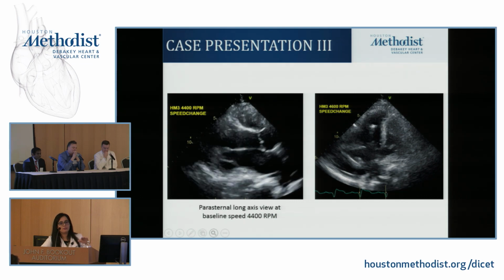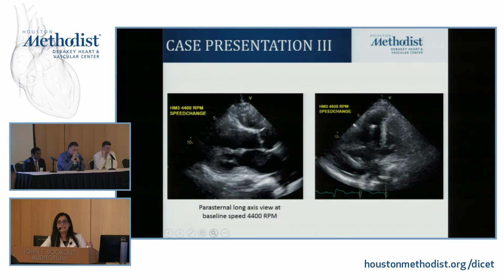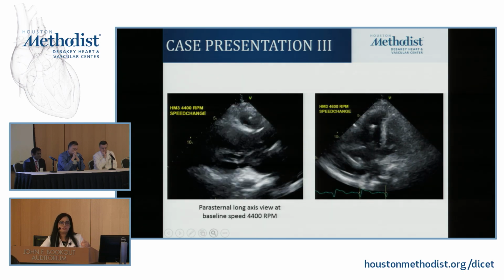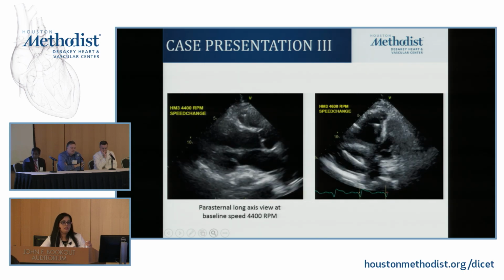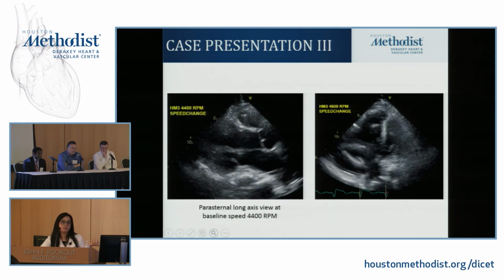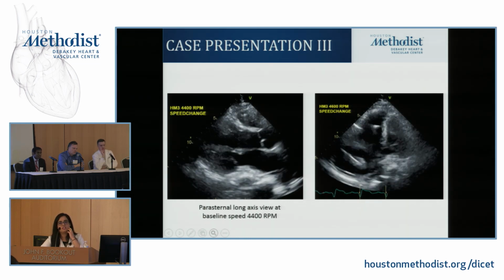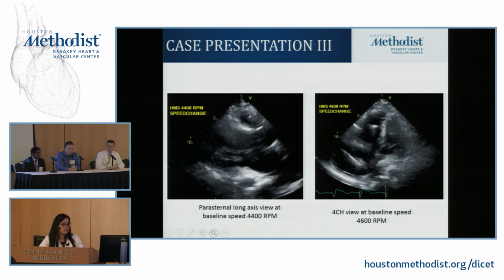Everyone was a little freaking out, and I was taking images at the same time, but before we circumvented the situation, I wanted to make sure I got this on imaging documentation, because it's extremely important to understand the concept here. Subsequent to that, we went down on the speed and the whole thing shifted back to midline. So this is the septal interaction that I was talking about: when you have somebody with an LVAD and you have a complete suck down, the key here is not to start giving more pressors. The key is first to drop the speed, because you know the septal interaction has been compromised, and see if that relieves the situation. And if that doesn't help, then we can always start nitric oxide or consider an RV support device. So this is the very drastic echo.